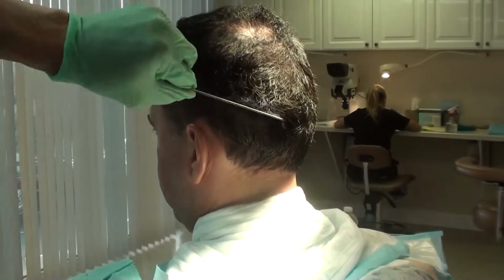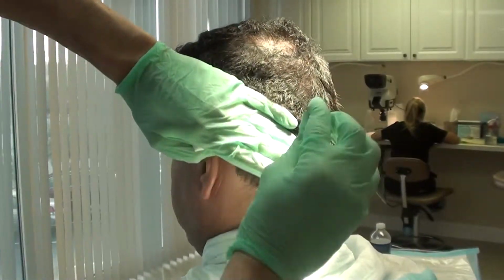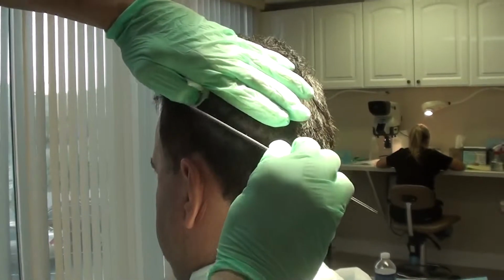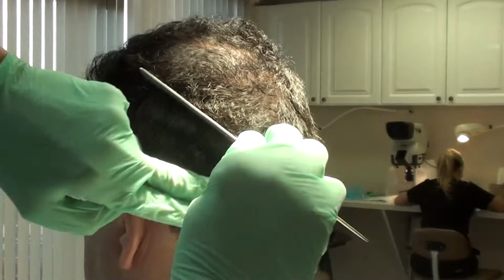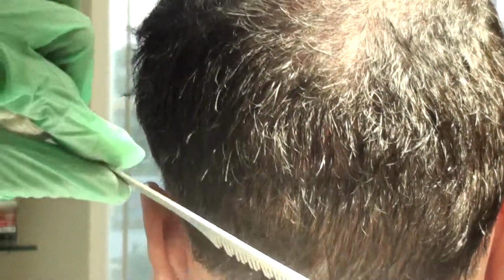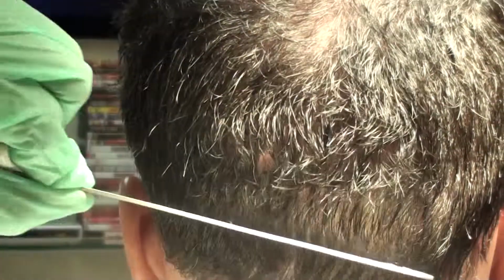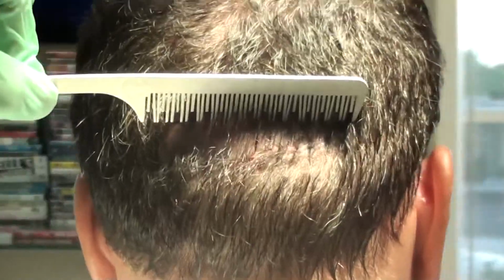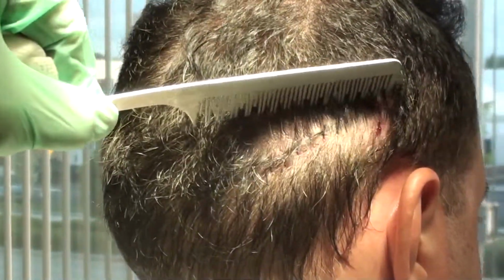We just did the procedure where we took that suture line, we harvested that donor. So let's take a look at this. This is that suture line right back there, hidden in there. So it's hidden within the hair. So now you can see the little suture line in there, hidden behind. So then the hair covers up completely on top. So it's 100% undetectable. Let's take a look at that. That's it, right there. So you can't see anything at all, the whole way around. And this is what it looks like when it's closed.